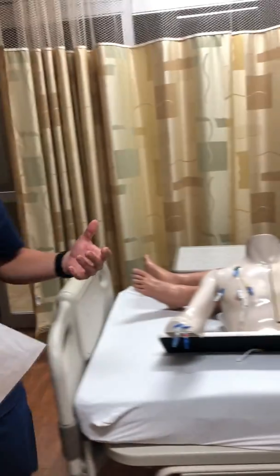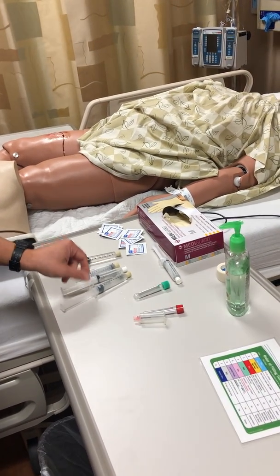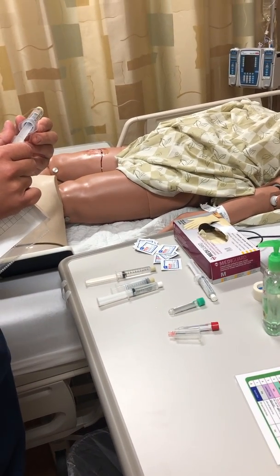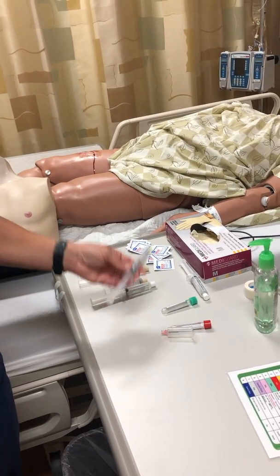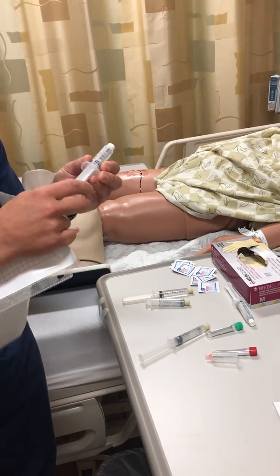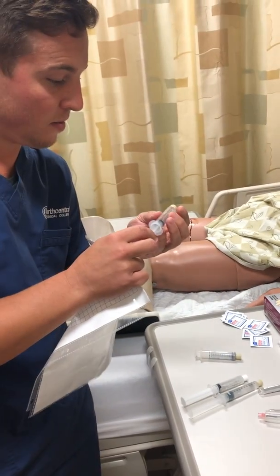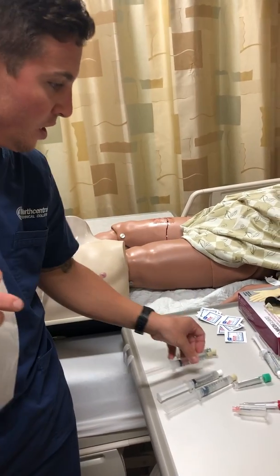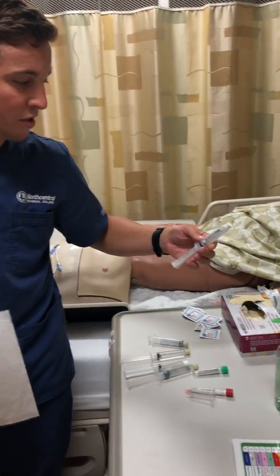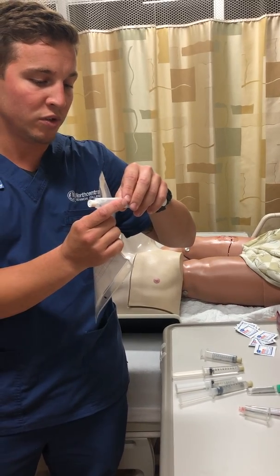This is what I'm going to be using. I have 3 saline flushes, and I checked the expiration dates on here, which are 4 of 2020, and 4 of 2020, and 4 of 2020 on here. Some facilities require a heparin injection as well. I'll check the expiration on this heparin, which is 4 of 2020.